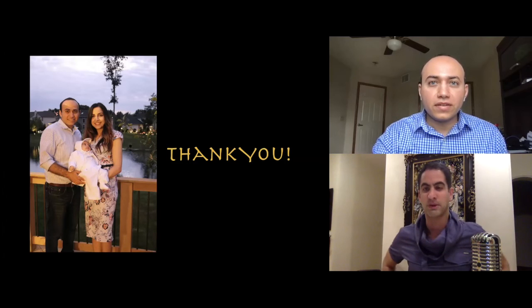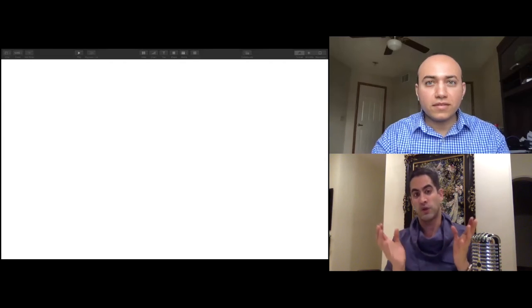Sure, sure. Your topic was also very interesting. I actually want to know your comments on some questions that I might have, and it may be common with our audience. Titanium mesh is one of the great techniques in augmentations, in vertical and horizontal, and maybe in vertical augmentations, it's more demanding compared to horizontal, because in horizontal augmentation, we have so many techniques that maybe even can work easier. But one of the concerns that people usually have about titanium mesh is its exposure, which, personally, I really don't think is the problem with the mesh, but maybe because it's rigid, the risk is going to be higher.